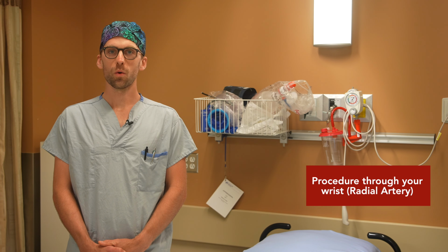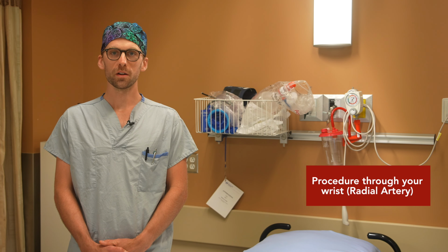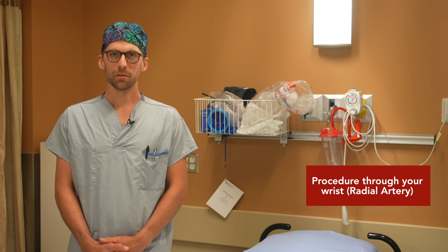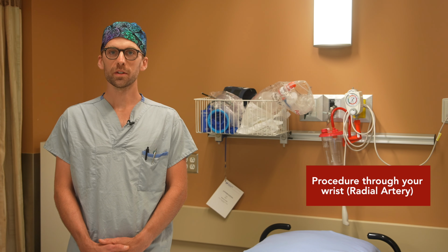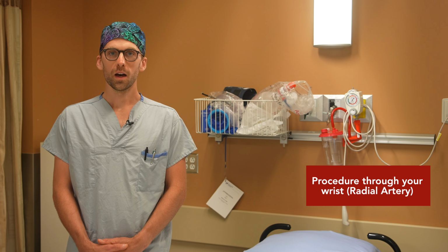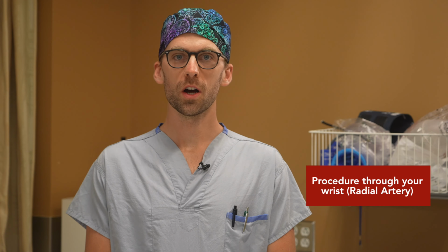Whether we've used your wrist or leg for the procedure, you will return to the recovery area where the nursing staff will closely monitor your vital signs and access sites for signs of bleeding. You will be required to stay in bed during this time. If you've come from home for your procedure, you will stay in the recovery area for at least 4 hours after your procedure while the nurses watch your recovery and make sure you're safe to go home. A light lunch will be provided once the staff determines it's safe for you to eat and drink. If you're an inpatient or have come from another hospital for the procedure, the staff will organize the return to your sending hospital or room as soon as possible.